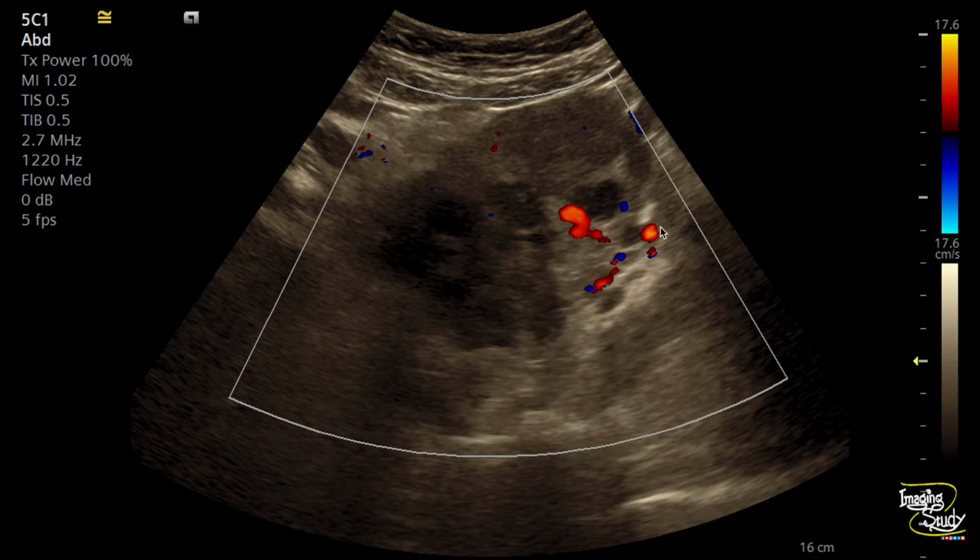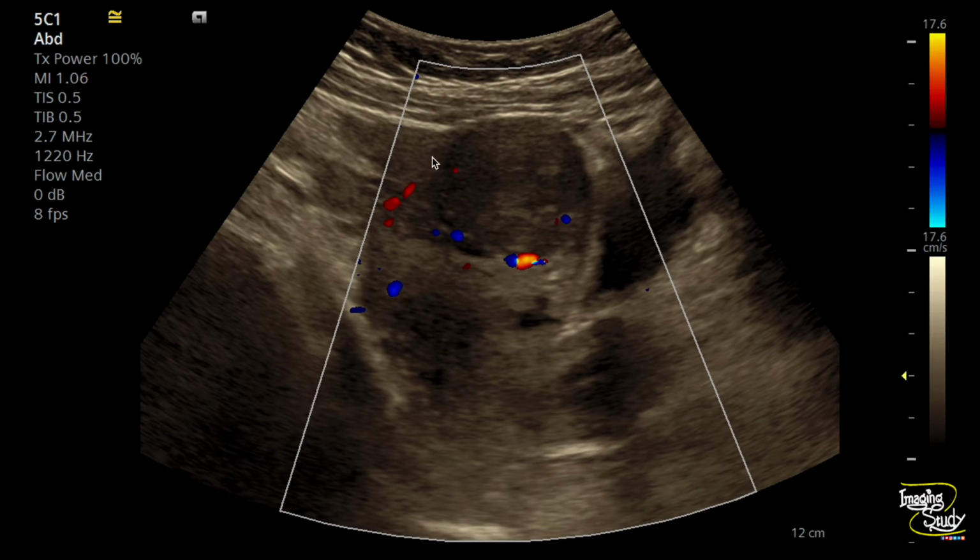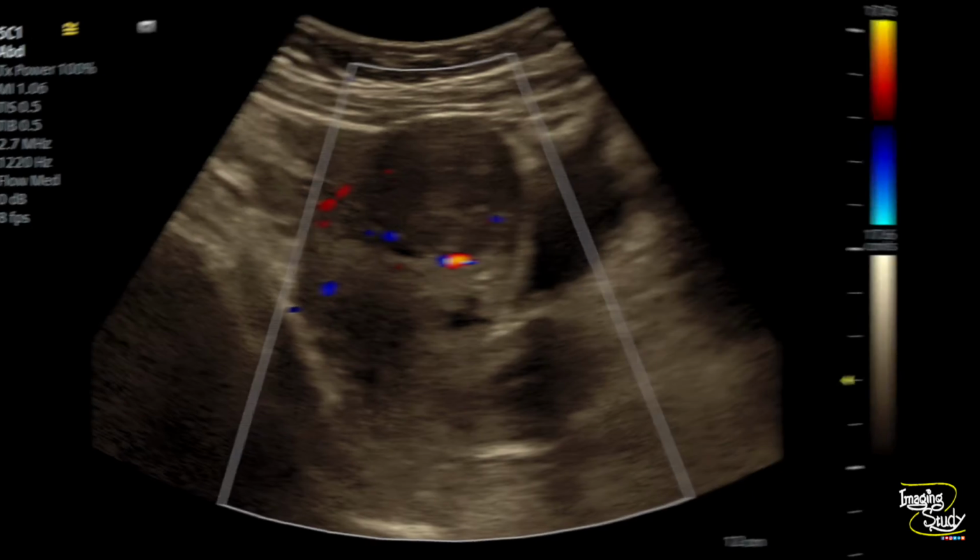On color Doppler, the myometrial vessels were quite prominent. You see, these types of large vessels are not seen at the deeper aspect of the myometrium. Here's another picture. It apparently looks like a fibroid and you can see prominent vessels around and supplying it. Let's jump into the transvaginal sonographic pictures.